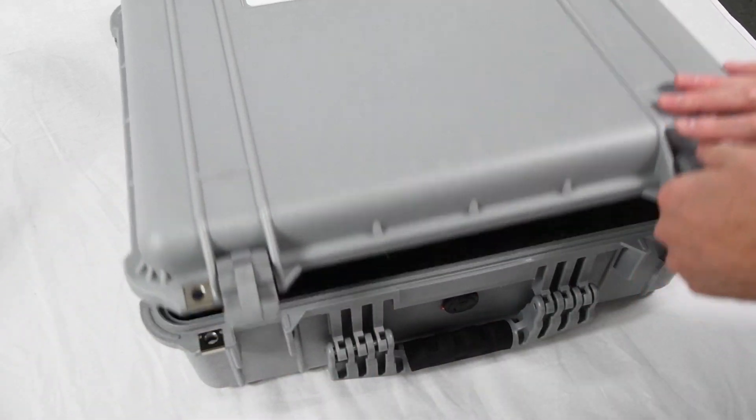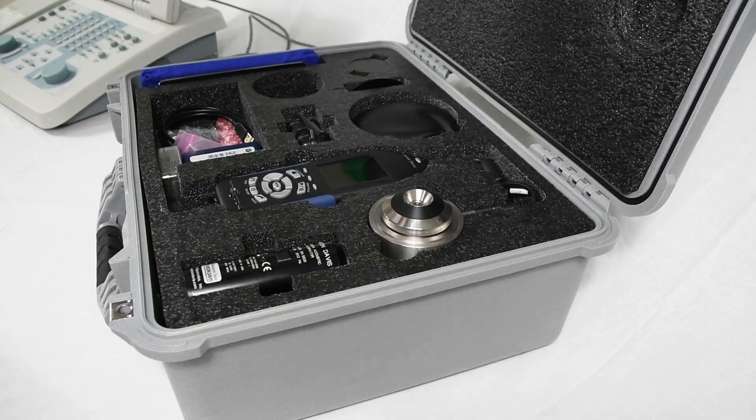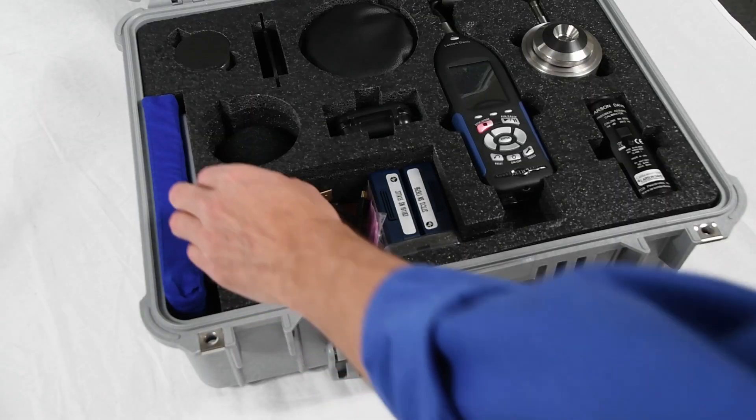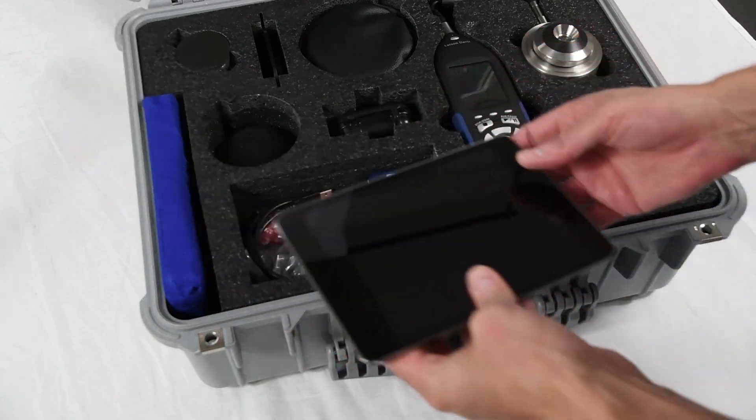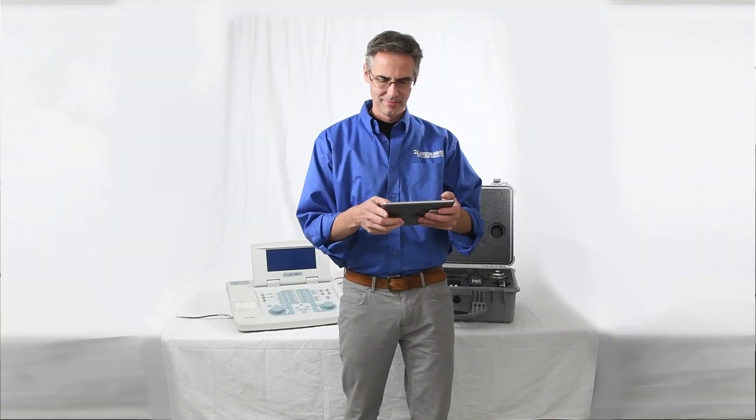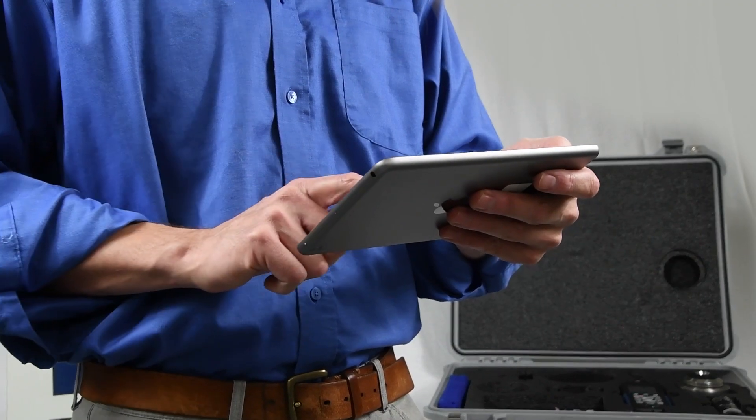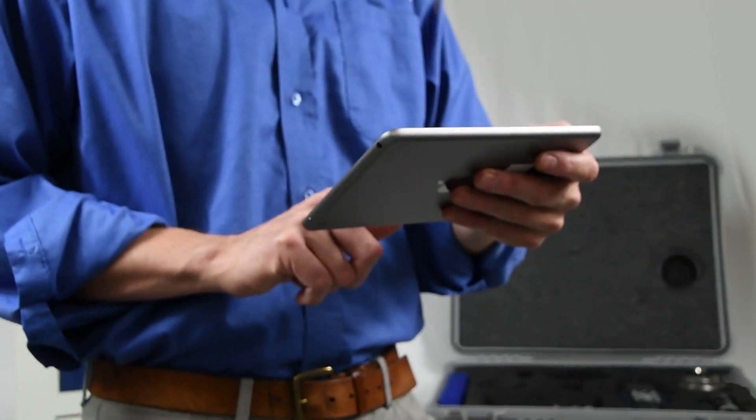In this AudCal tutorial, I'm going to show you how to connect to your AudCal 831c sound level meter remotely using a tablet, like you might do at a testing location.